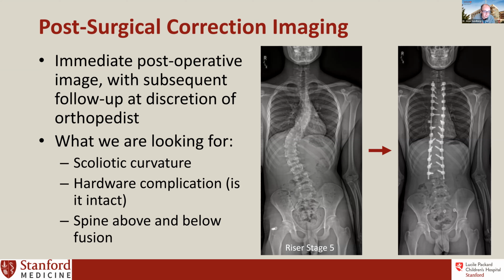But yes, it is pretty standard for us to put a block under the foot so we get a neutral positioning of the lower extremity, so we can fully assess the pelvis and the spine without the leg length discrepancy affecting it. Absolutely. We do instruct our techs to do that if they see it, and we've promoted with our orthopedic surgeons to put that in the order form and communicate it with us.